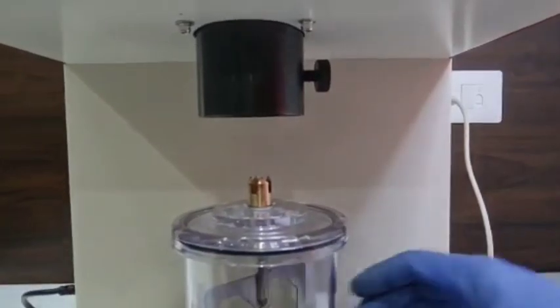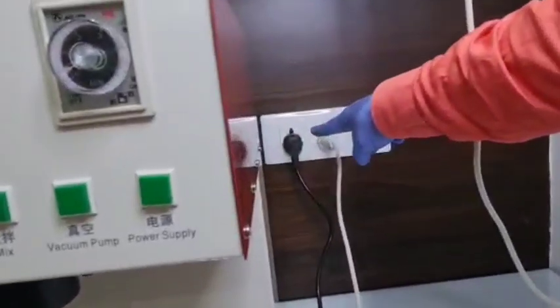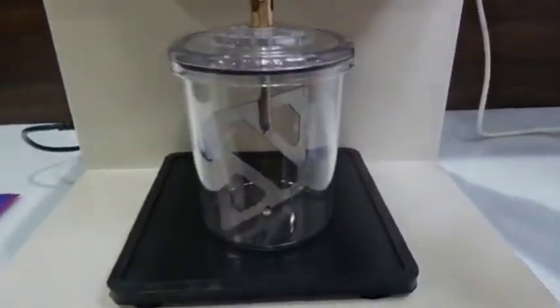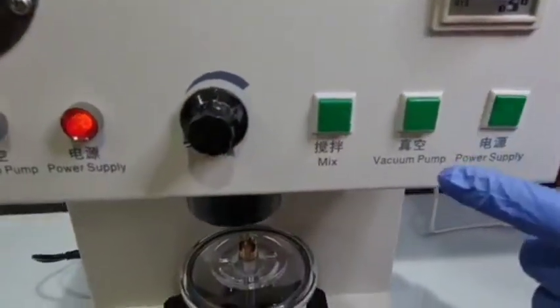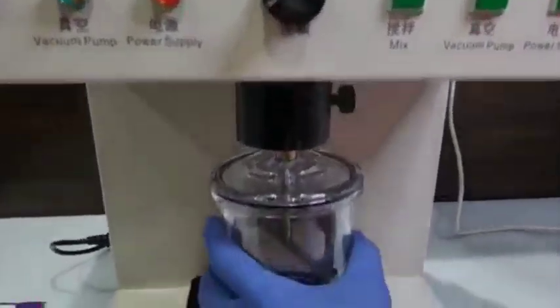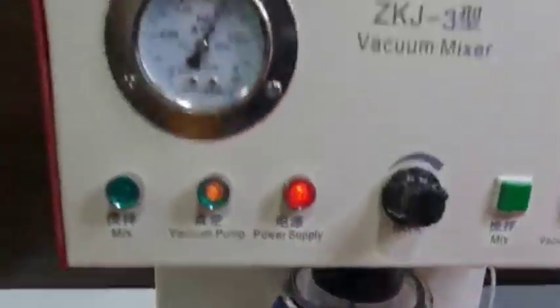Now, let's see how it works. First, you will attach this machine to the wire which is in this corner, and this will be attached to the very left corner over here, and the jar in which you will put the investment material. Switch on the power supply button and the machine will start working. Then activate the vacuum pump and attach this jar here in the middle. Balance it properly.